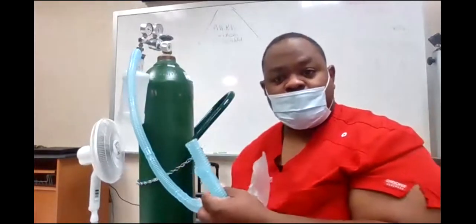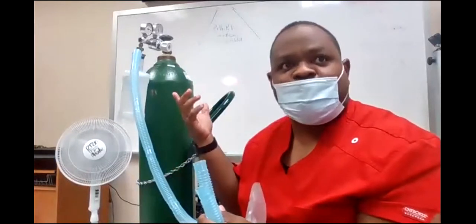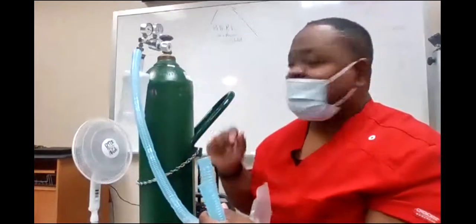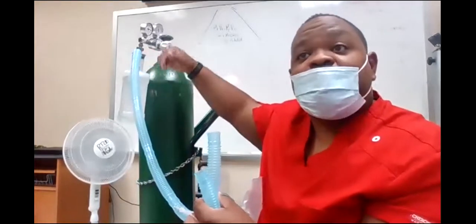See how the sound went down? You increase the FiO2, you decrease the what? When you increase the FiO2, you decrease the flow. And you can hear the flow has went down. It ain't real loud no more. It's 100%. I got it set on 95%. So this is 95% oxygen coming out of here with some aerosol, okay? And since you don't hardly hear it, it's because I turned the flow down.